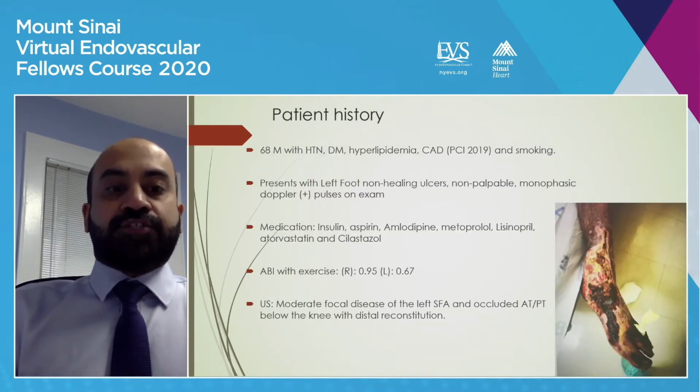For my case today, I chose a case of critical limb ischemia from the last few weeks of my endovascular fellowship. This case highlights the importance of the choice of equipment and technique used for restoration of inline flow to the foot in patients with critical limb ischemia.